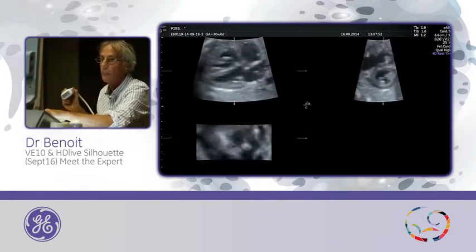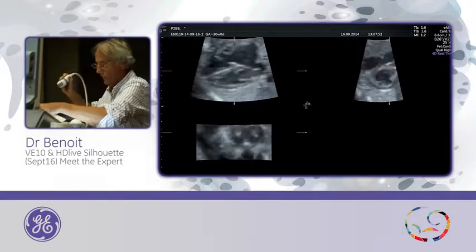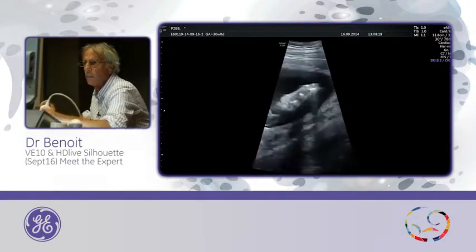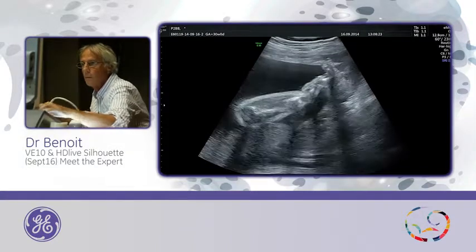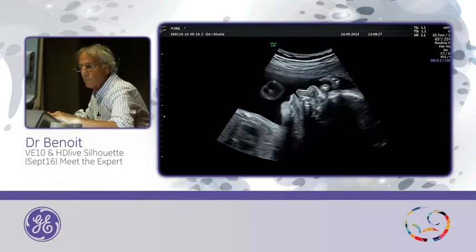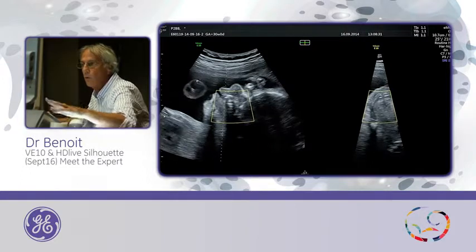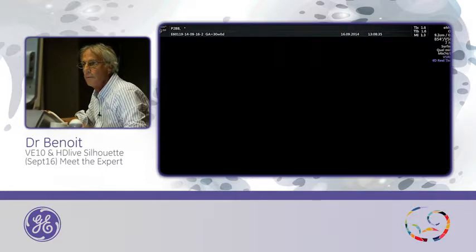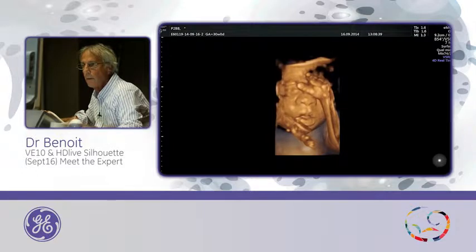That means it's really fast, and the quality, you can really work with this. Now I really like to use 4D.